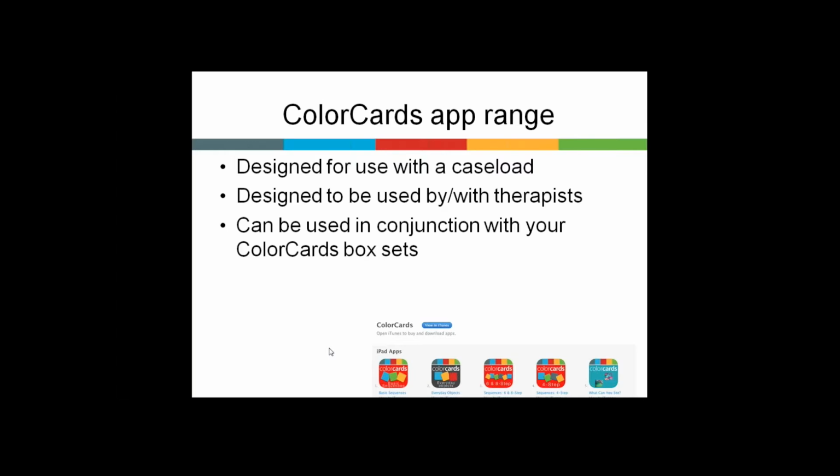One of the things to bear in mind is that the apps have been designed for therapists. They can equally be used by families and patients themselves. They've been designed with therapists in mind because there's a caseload tool, so you can have multiple clients using the apps. You can store their progress and then come back and review that the next time.